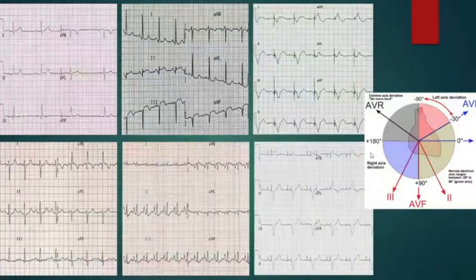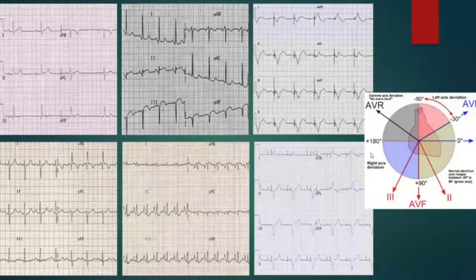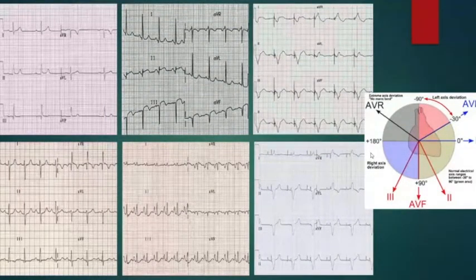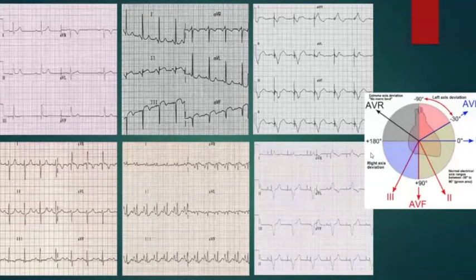You just don't have to bother with the mathematical analysis, like what a vector is, what a biphasic lead is, what a monophasic lead is. You just need lead I, aVF, and the most equiphasic lead. And that's it.